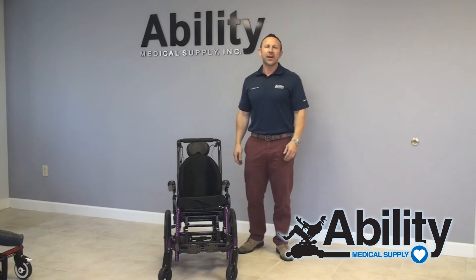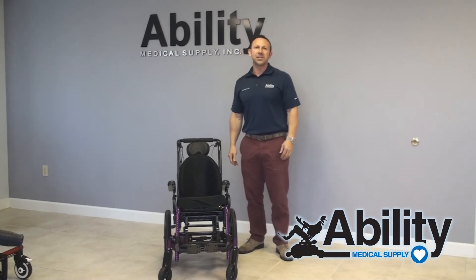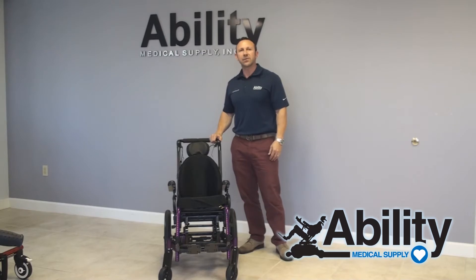Hi everybody, Jed Golding, Director of Rehab with Ability Medical Supply. Today we want to introduce you to the new Key Mobility Focus CR. CR stands for complex rotation.